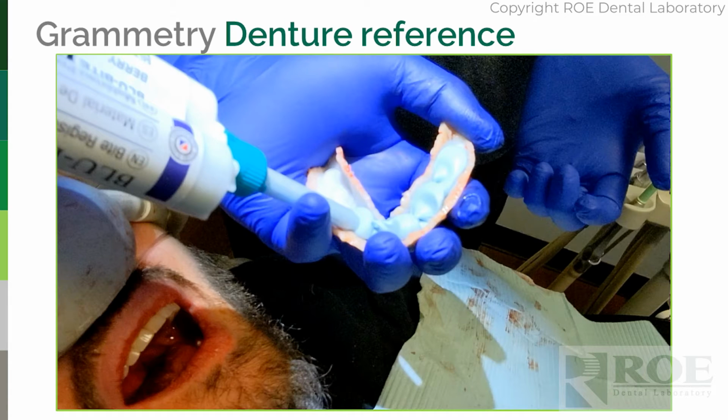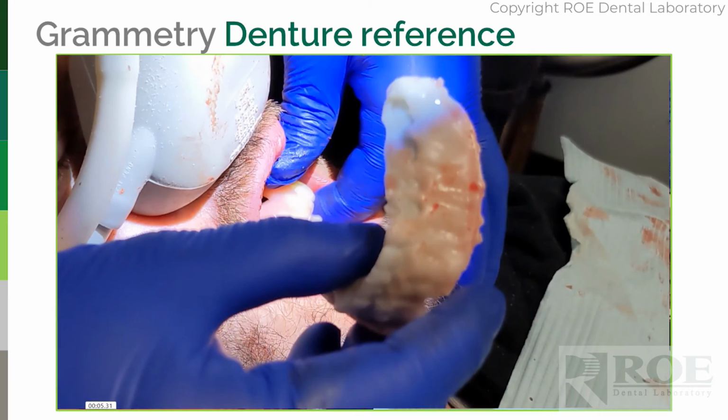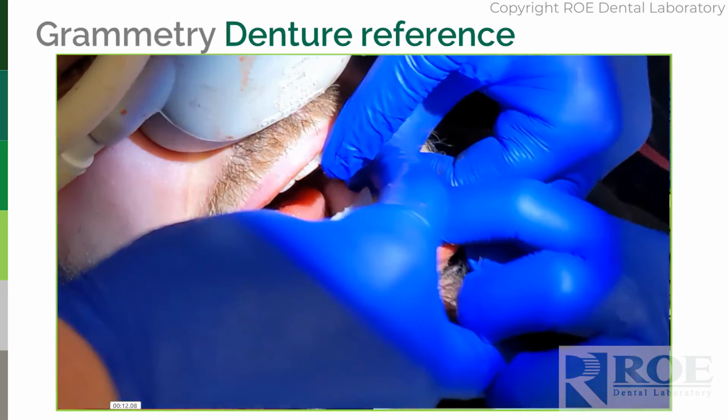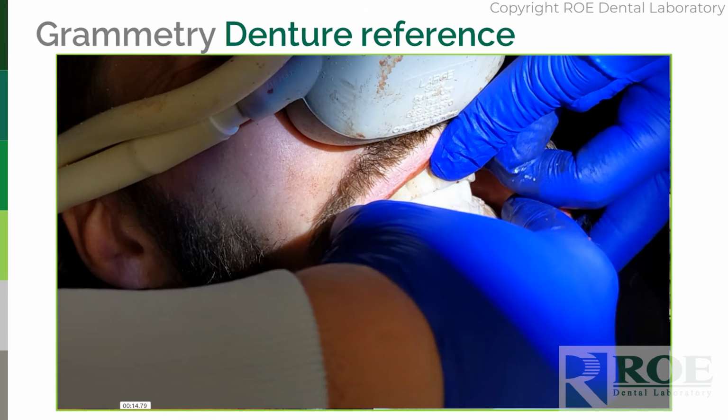And in that situation, you will load both dentures with impression material, okay, and you will seat them, because this is really what we want. This gives us everything in one scan. So the upper is already in. Just simply load the denture with material, seat it, and close and hold in position.